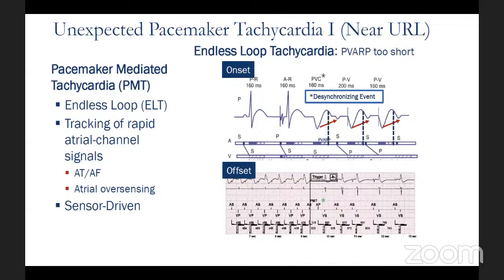But I'm not a smart electrophysiologist. I'm just a humble general cardiologist. So I have simple questions, which are very practical for our patients, and we get asked those questions. I have two actually. One, I'm going to lump a number of things in one question: the effect of cell phones, radiation treatment, and those devices that the elderly wear to call for help. Do they interfere with the pacemaker function or not?